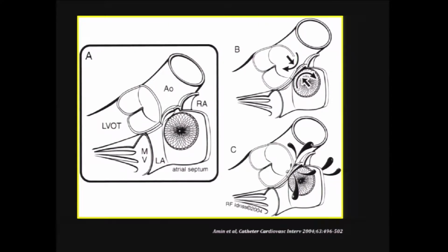So he emphasized the importance of the length of the anterior rim, but in many cases there is no sufficient anterior rim, and yet we have rarely observed this kind of serious complication. So next I will show you the specimen.